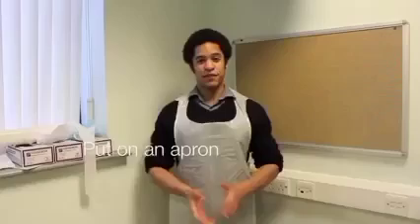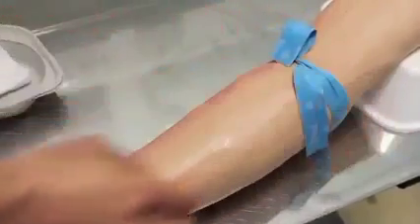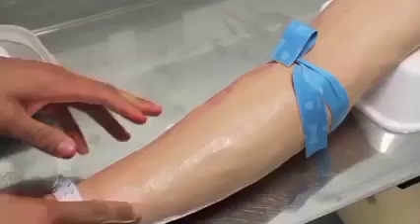Ideally you'll have an apron on for this procedure. I'm now going to put a tourniquet on — tell me if it feels too tight. Does that feel okay? Apply the tourniquet to help you feel the patient's veins.